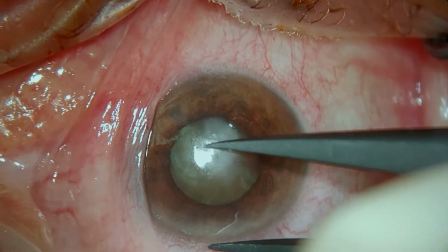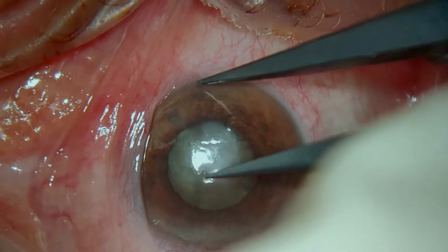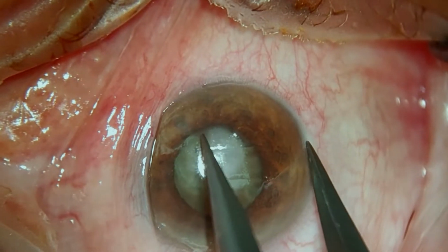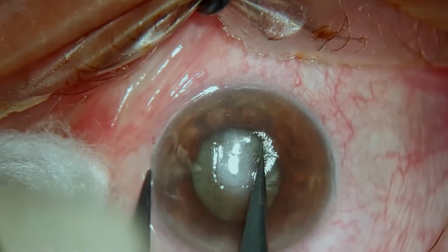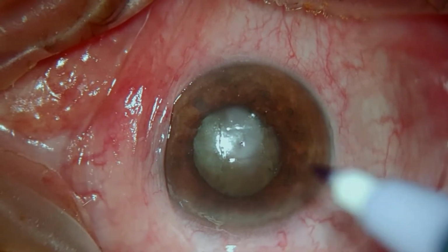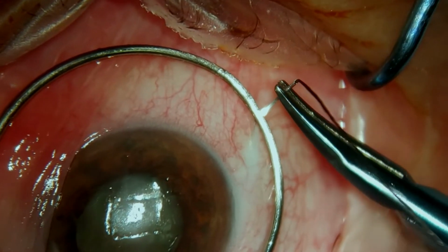This is a 60-year-old female with a history of corneal ulcers bilaterally. We're starting off the case with marking the corneal center. We use a caliper that's preset to about 7 millimeters to draw some inkless marks on the cornea. Then we mark the center with a gentian violet pen.